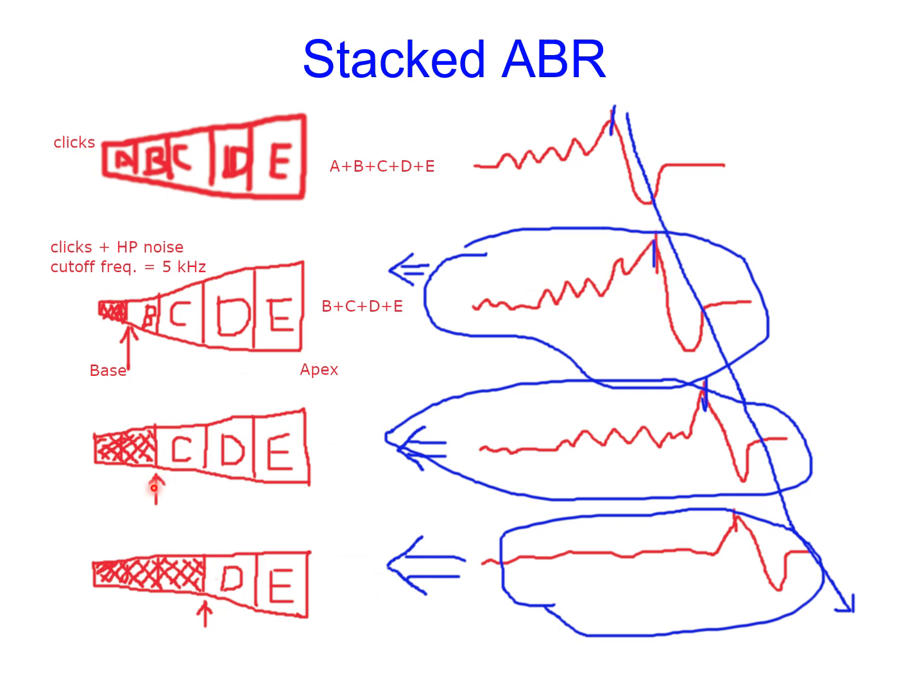Now if we change the cutoff frequency from here to here, the cutoff frequency is more toward the apical end, which is the low-frequency component. In other words, from the second to the third condition, we decrease the cutoff frequency of the masking noise.